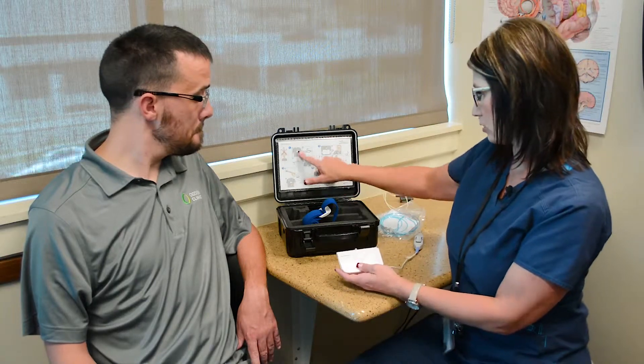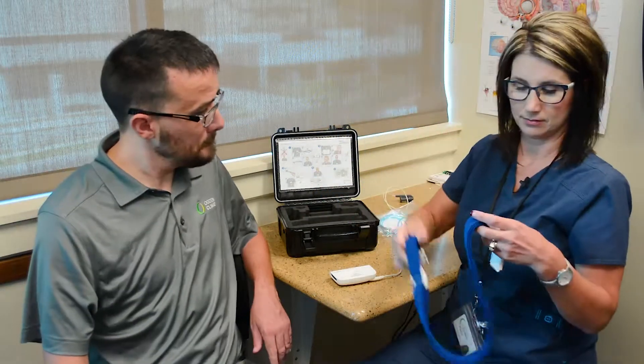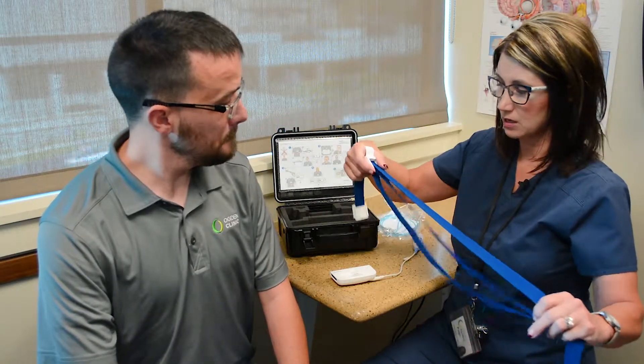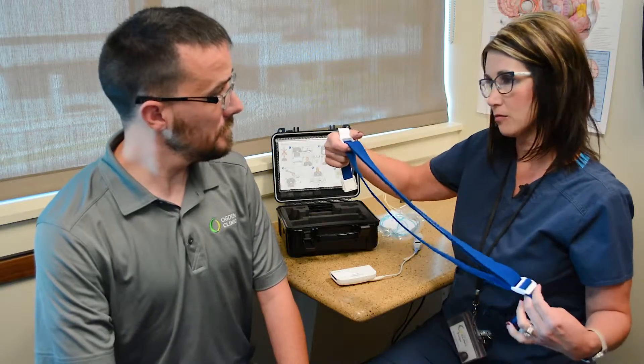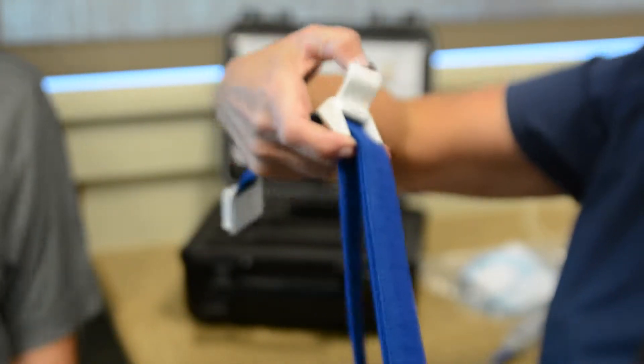Our next step is we're going to go ahead and start with the belt. It does have an adjuster on it — you're going to make it bigger or smaller, however you need it. You don't want it so tight that you can't breathe, but you need it snug enough that it's going to stay in place. You'll adjust it to how big you need it.